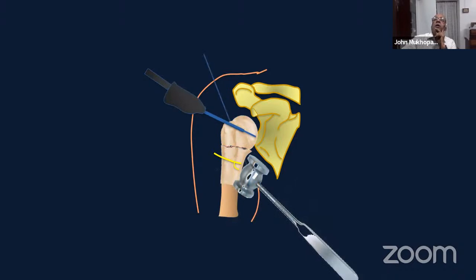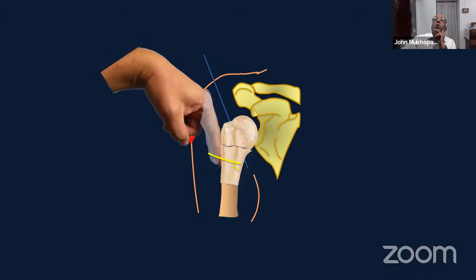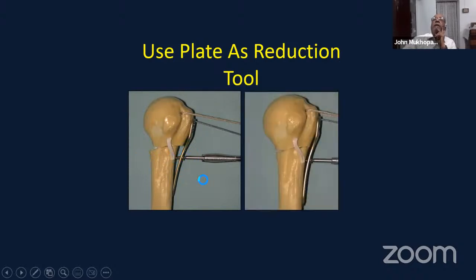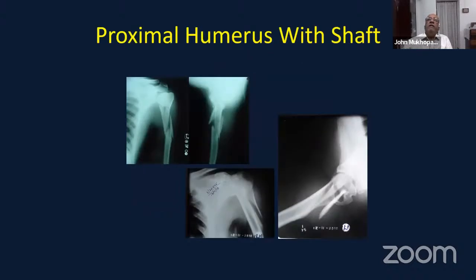And of course, put provisional K-wires to hold your reduction. Make sure you felt the axillary nerve before you slide your plate down. And even the plate can be used as a reduction tool if the shaft is a bit medial. When you put your first screw, put a conventional screw and it will pull the fragment and reduce it. So these are various tips and tricks for the proximal humeral fracture, which would help you reduce the fracture and then go on to fix it well.